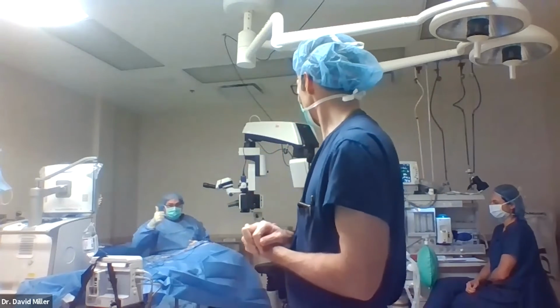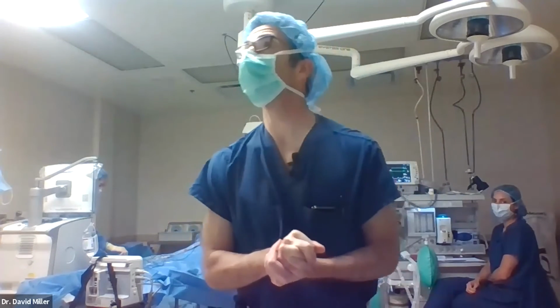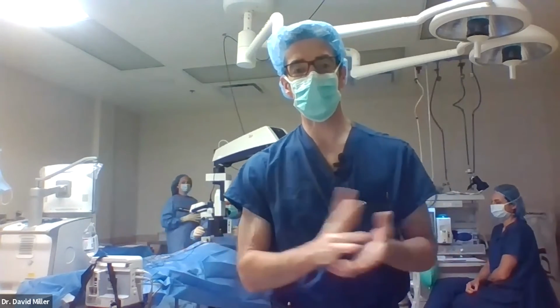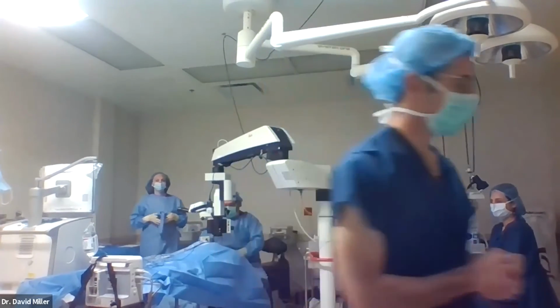How are we doing? About set? Okay, so our next patient is set. I'm going to jump to that, and however long the case wants to go, if you guys want to stick around, it's fine. All right, get it going here.